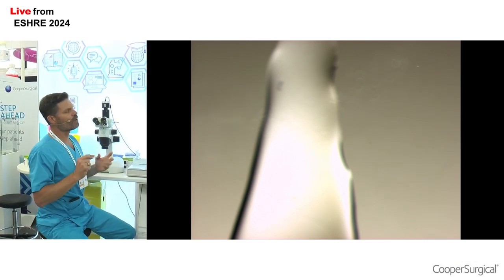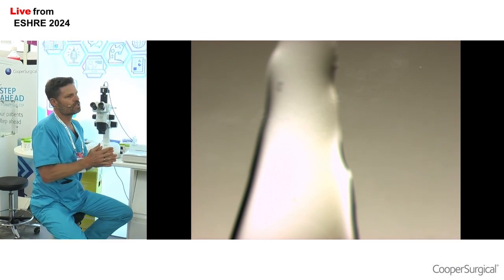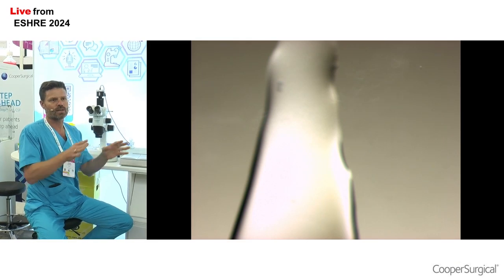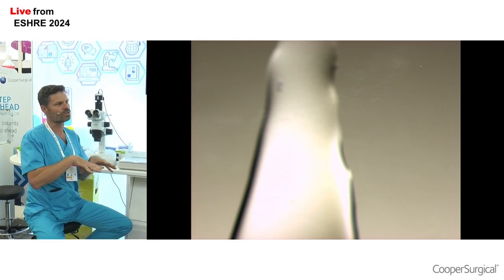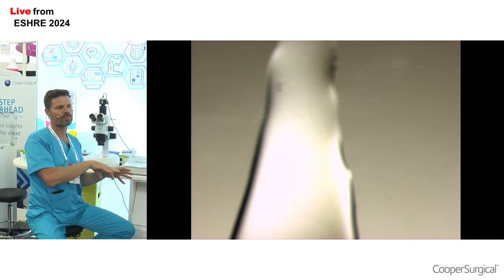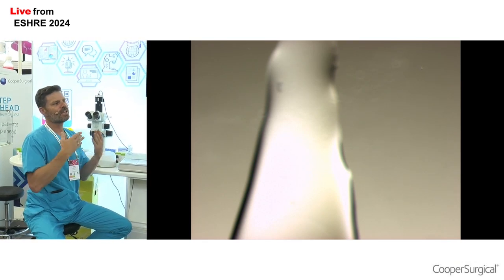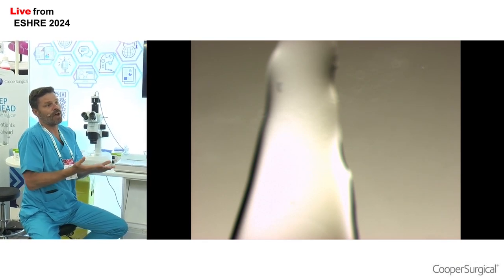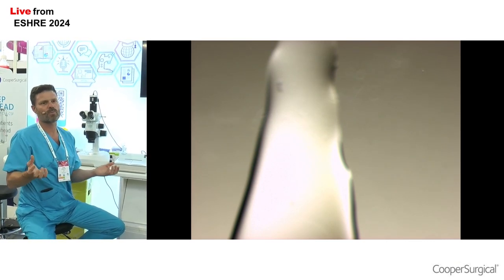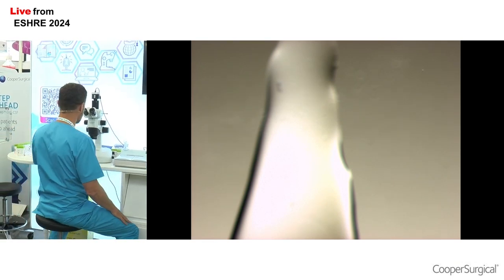The reason I did 3 different concentrations is, let's say we have a really good sperm sample with low DNA fragmentation, there's probably going to be a lot of sperm binding in that area, so a higher concentration of bound sperm. In that case, I'll probably go to the less concentrated drop, which will help me select those sperm. If there's a lot of DNA fragmentation and very few sperm binding, I might need to go to the more concentrated drop to find the sperm which is bound. So it's just some little practical tricks to help us with the process.